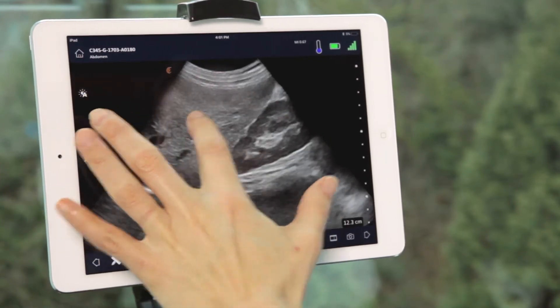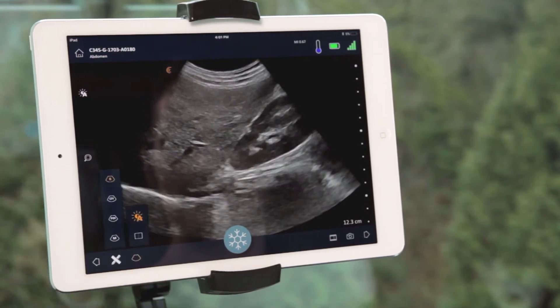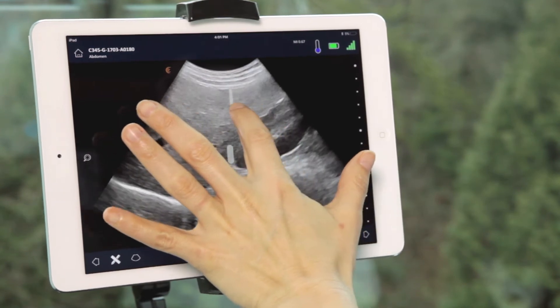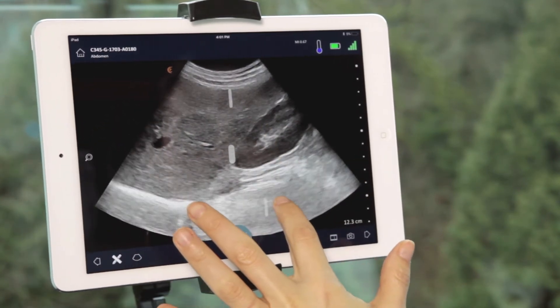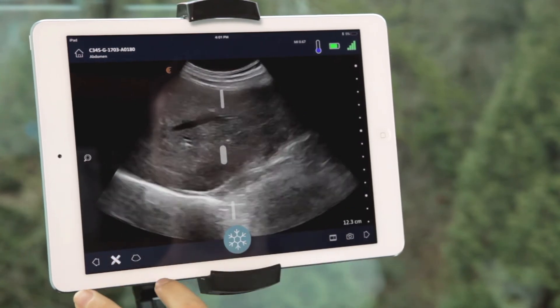Slide your finger up and down to change the depth. By default, the automatic gain is on. To disable this, simply press the image icon and then the orange auto gain icon. You can then adjust near field, far field, and overall gain using the horizontal sliders.